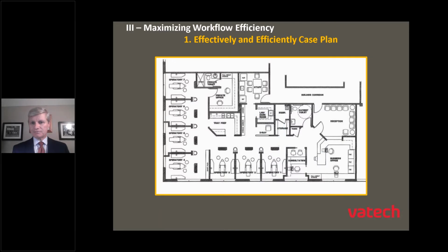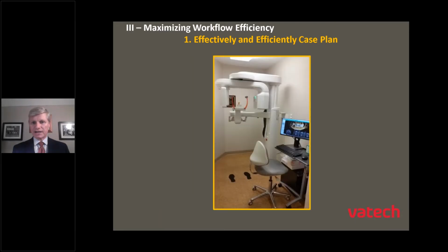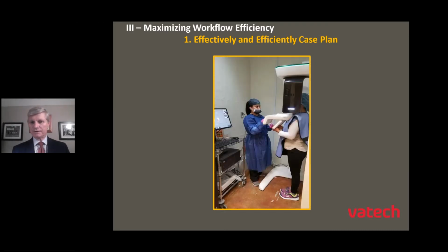And one last thing to request is to avoid using the x-ray room. This is a perfect example. Went to an office, the doctor was treatment planning on the acquisition PC when I came in there. And it's a different office, but an example came in where they needed to take a CBCT scan on the patient, so that, you know, interferes with your workflow, because now you have to take a break during your treatment planning, scan the patient before you go back there again. So I definitely recommend at least having the 3D software installed on at least one other computer in your office, preferably away from the patient, to do your treatment planning.